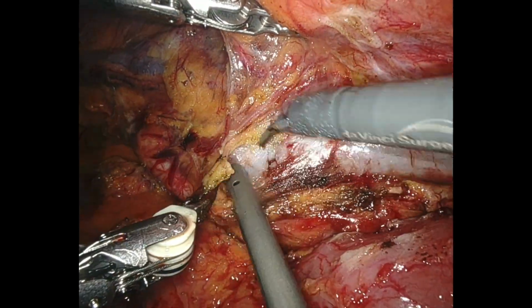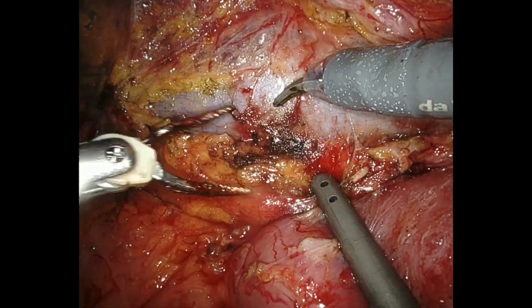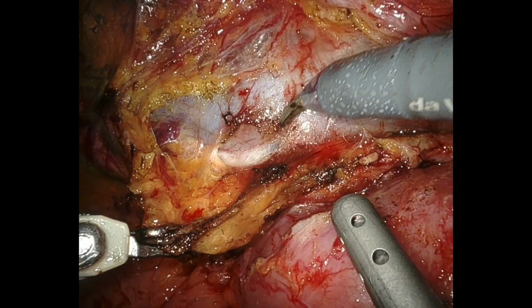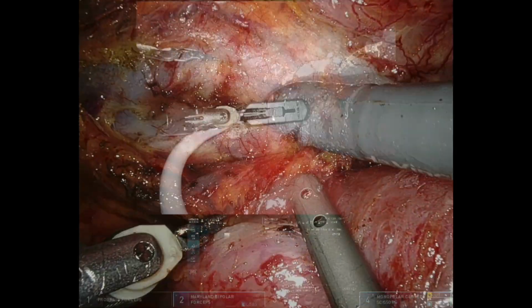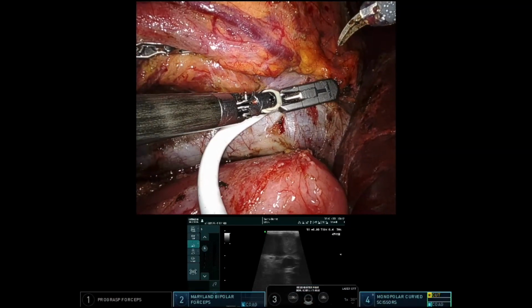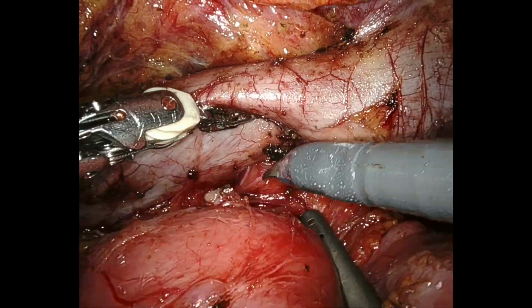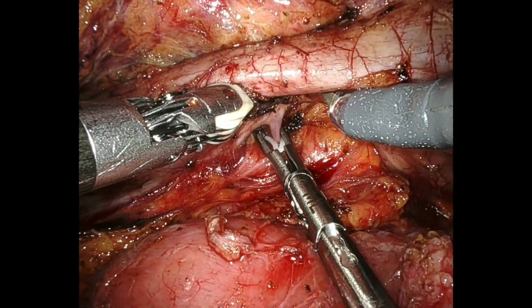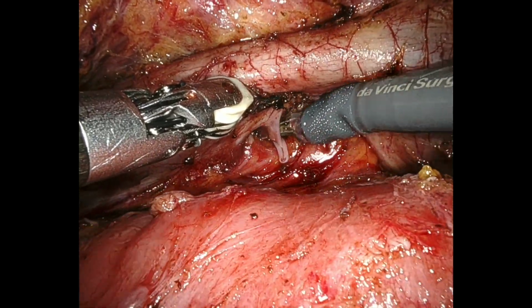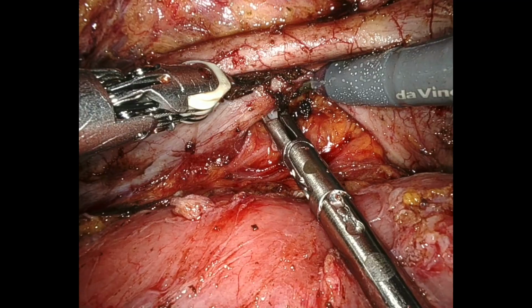After colonic detachment to locate the psoas plane, the ureter and the genital vein, the anterior and the lateral sides of the vena cava are dissected and released. Intraoperative ultrasound is then performed to visualize the thrombus extension. Dissection is extended to the posterior face of the vena cava, where the lumbar veins are progressively clipped and sectioned.